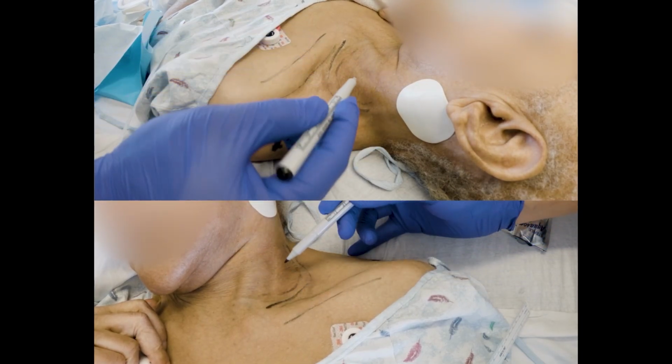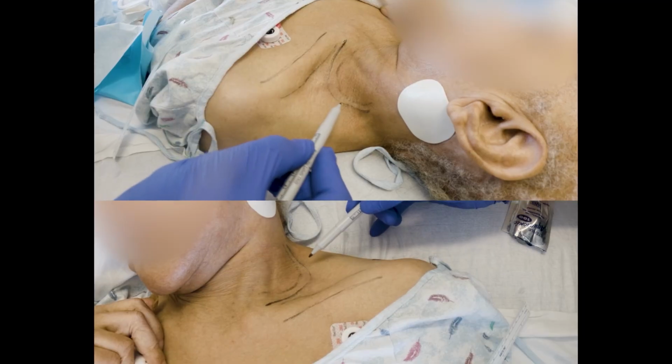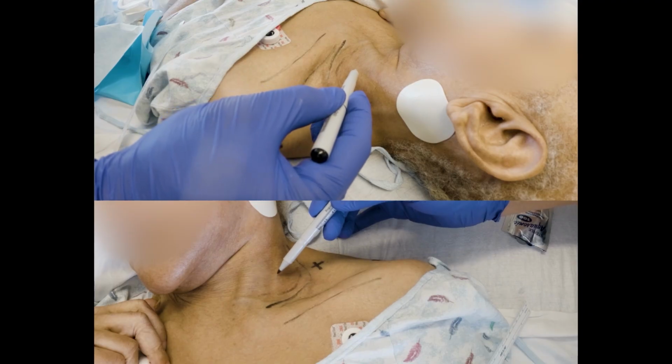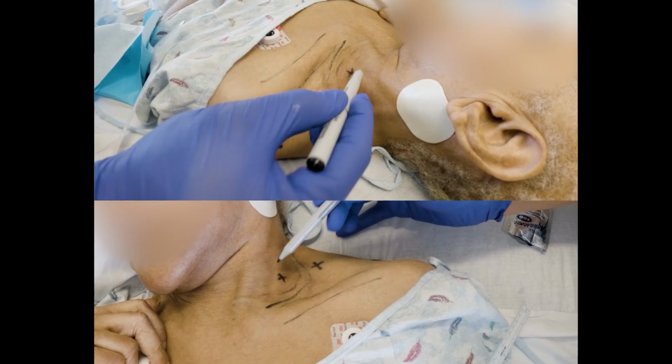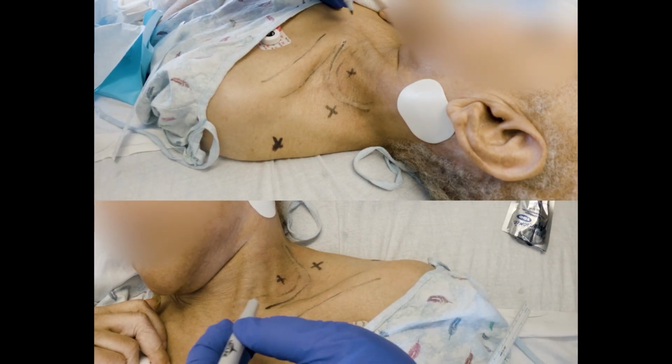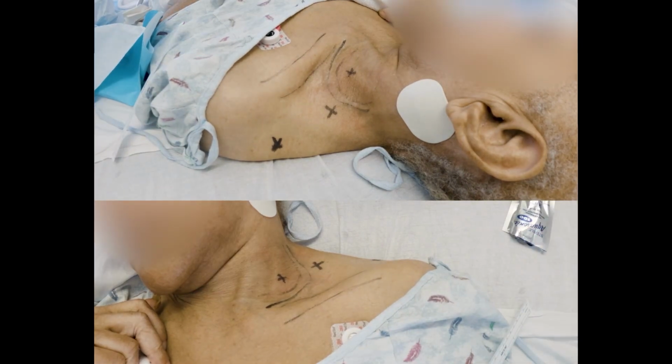Our EJ's here. We're going to have to needle from here, and then we'll probably tap it at about here. And we're going to go underneath and hook underneath that EJ. And then what is going to be our final length of the catheter?